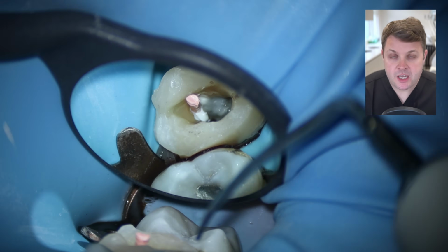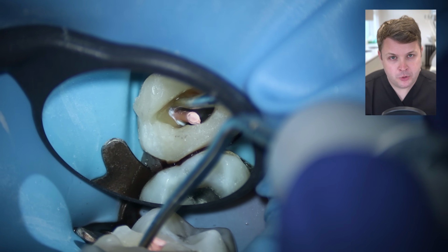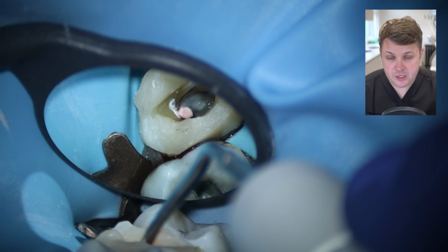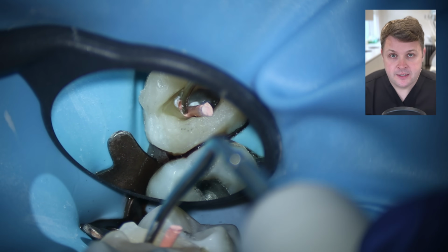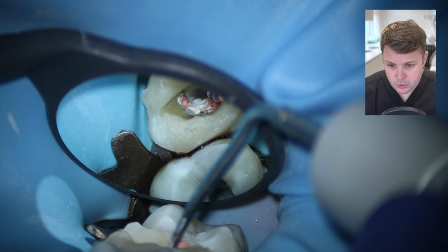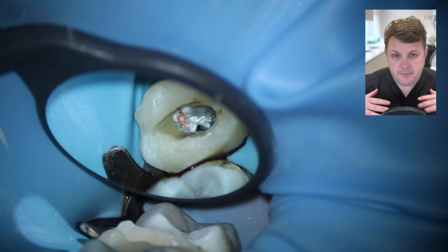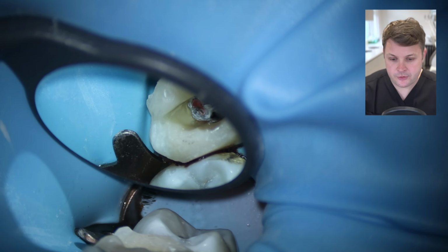We're then going to use my heated plugger just to remove the excess. I don't cut the excess off too far down, because I want enough for us to push down into the canal orifice, and once we push the GP cone quite far down, that's going to make sure the bioceramic is pushed into all the little nooks and crannies.